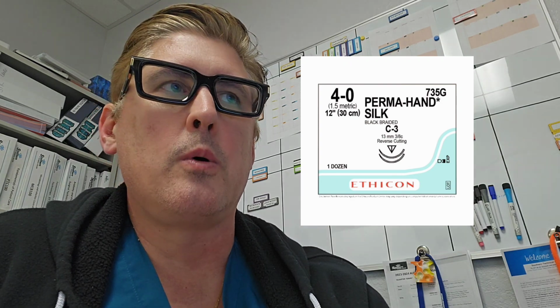Another non-absorbable is silk. That is a multifilament. So nylon and silk are very similar. The only difference here is nylons are monofilaments and silks are multifilament, a little bit stronger. So yeah, they use it for surgical drains, holding the drain in place. They have good flexibility to it, so they can be used to tie off vessels on occasion.